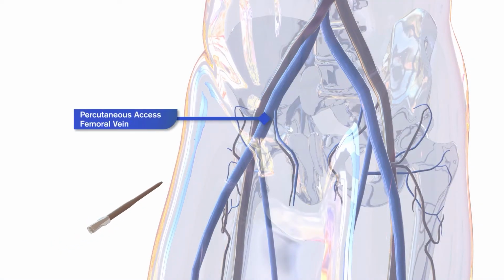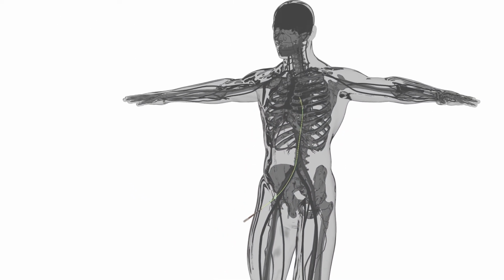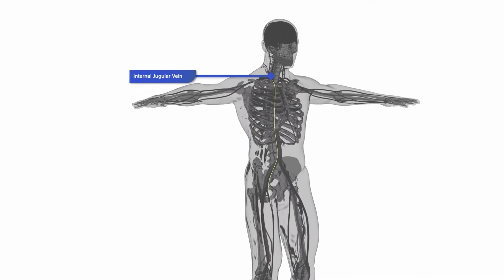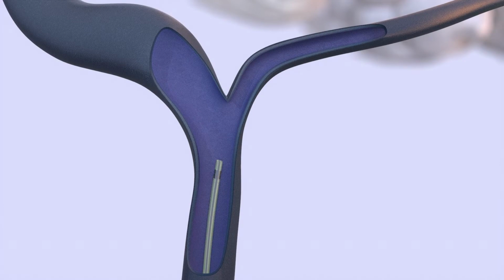The operator will first establish percutaneous venous access to the femoral vein. Using standard access tools, the operator will advance through the venous vasculature, through the internal jugular vein or IJV, and gain access to the inferior petrosal sinus or IPS using a guide wire and a recommended microcatheter.